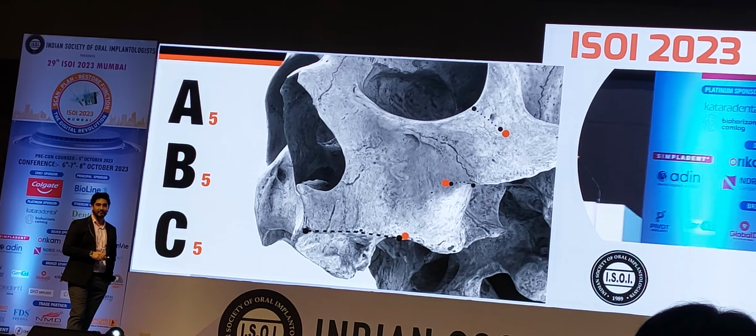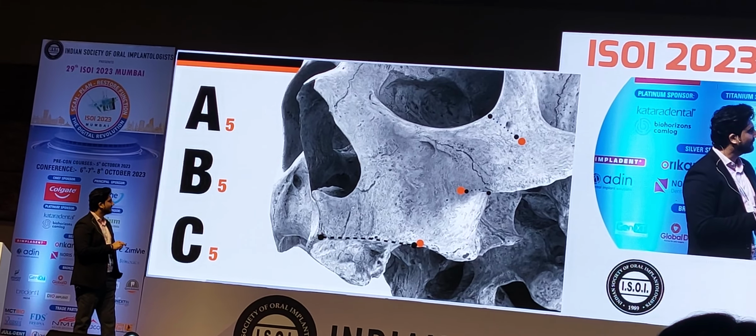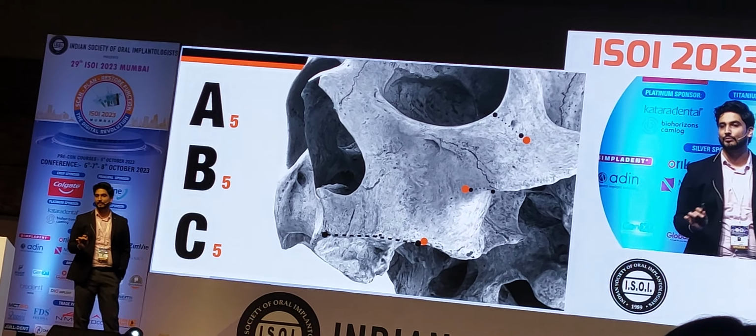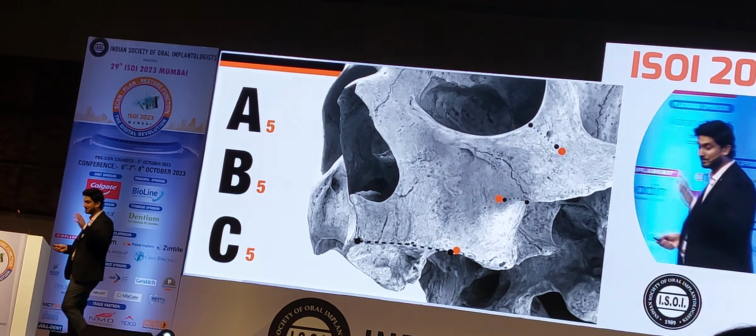And what is C5? And I can give you a guarantee for this. I have done a 30 CBCT analysis that when you follow A5 and B5, your C will always be more than 5 mm away from the orbit. Actually it is more than 15 mm away, but rhyming ABC 555 sounds better, so it is better perhaps for understanding.